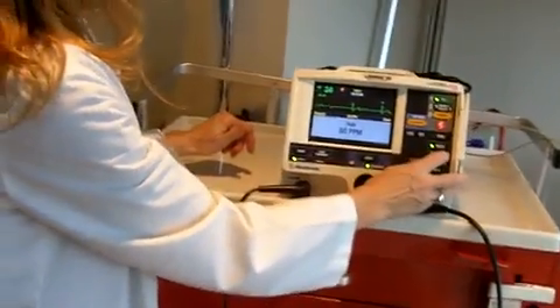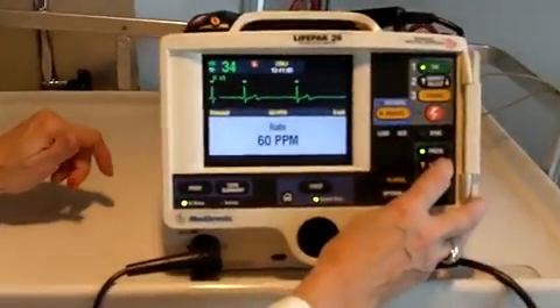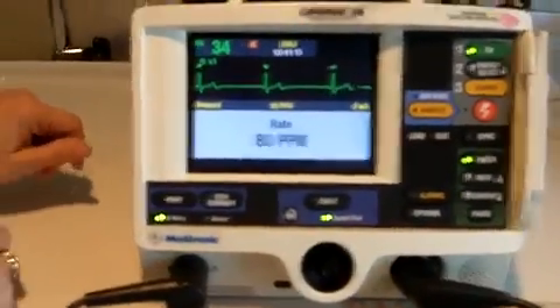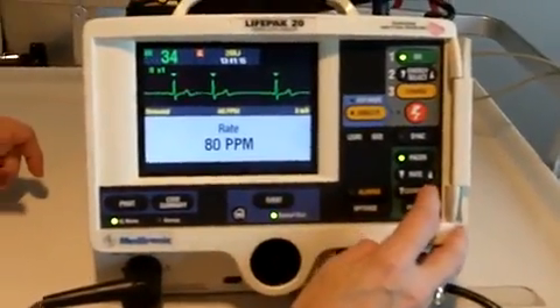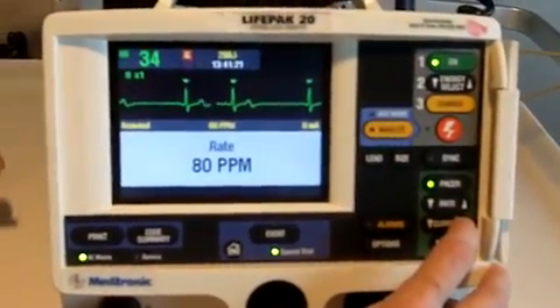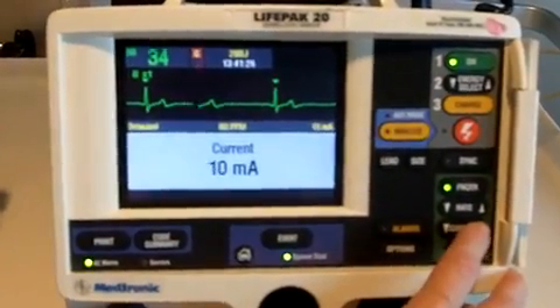I now want to dial in what rate I want it set at. I can choose from 30 to 180 pulses per minute. I'm going to select 80. I then want to dial in how much electricity I want to deliver to the chest wall in order to provide a contraction, and this is measured in milliamps.